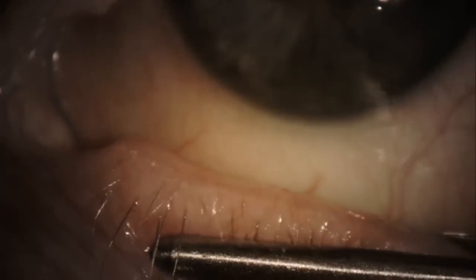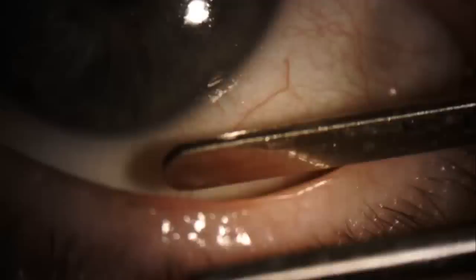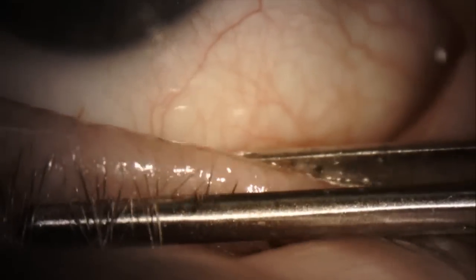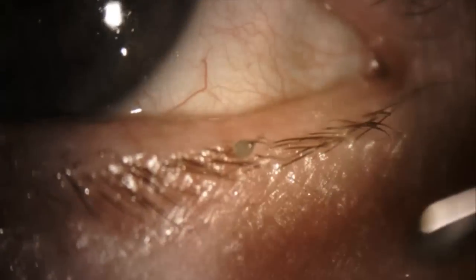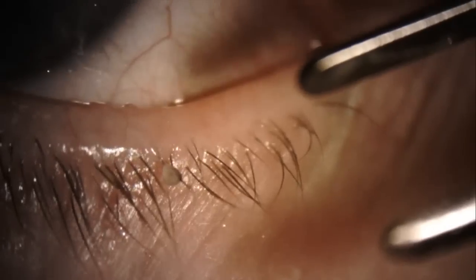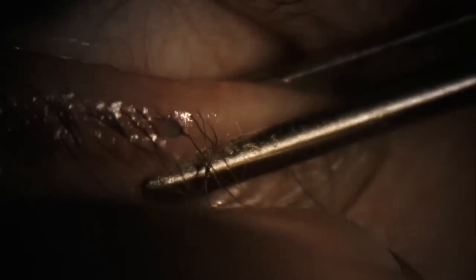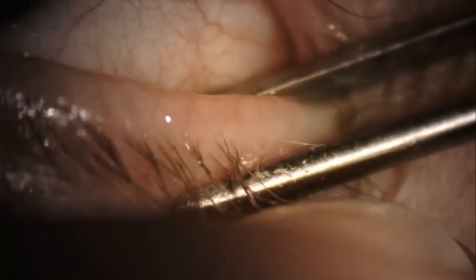And again, nasal from the fornix towards the meibomian gland orifices, and a significant amount of pressure is placed there to achieve this, with the goal of getting as much meibum out and hopefully ending with clear meibum coming out if possible. Sometimes some meibomian glands are either atrophied or will not open, and sometimes it's not possible to get all the glands, but most of the time you can get meibum from the majority of them, if not most or all of them.